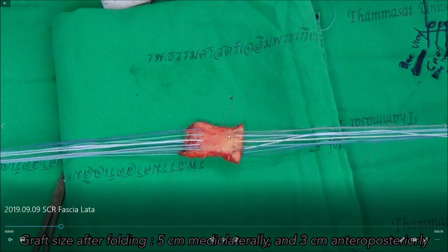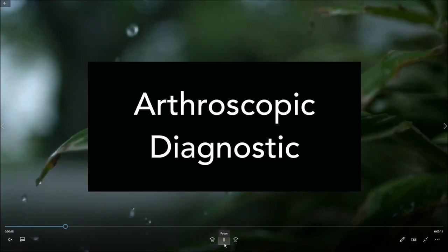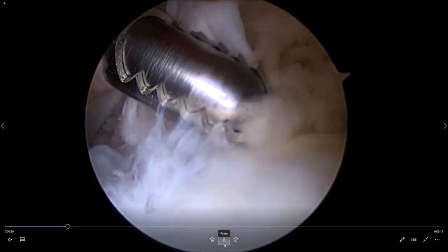I put sutures in like simple sutures, and these sutures will be passed like a shuttle. The sutures should be in different colors so you don't get confused. Then we proceed to the arthroscopic preparations.